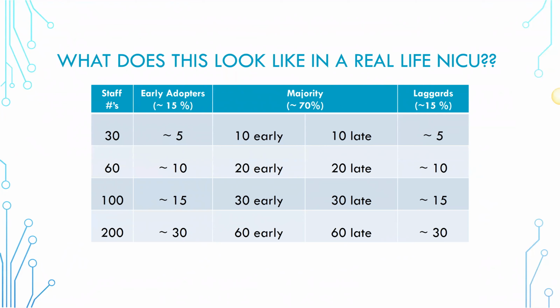Bedside nurses, and so if you're doing needles, it's one thing because that's not a super time intensive procedure. But if you're doing hydrogel, it is important to know that it can take people 30 minutes, 40 minutes, even if they're skilled, to get the hydrogels on well. And so planning for that in your team and knowing who's going to do that. Is it the bedside nurse who's taking care of the baby and everything else? Well, they may not have time to get to that sensor application for hours. And so making sure you've got full resources available so that you can get to that is really, really critical. And sensor application is the Achilles heel for this, and I say that all the time.